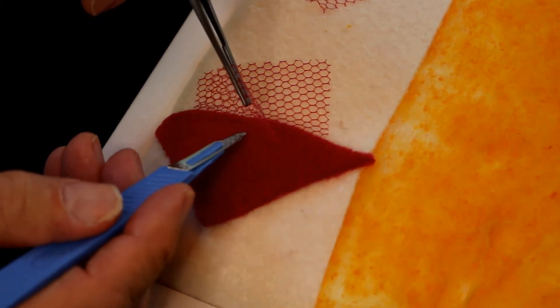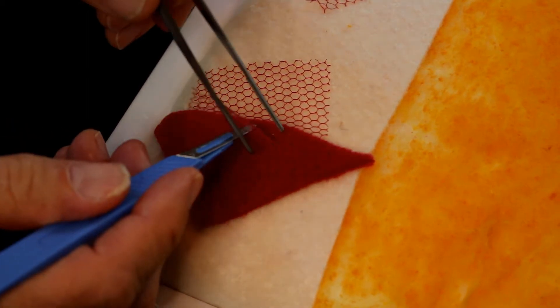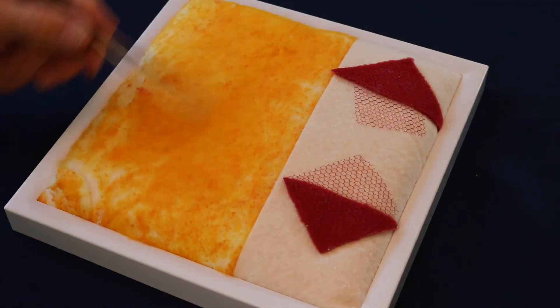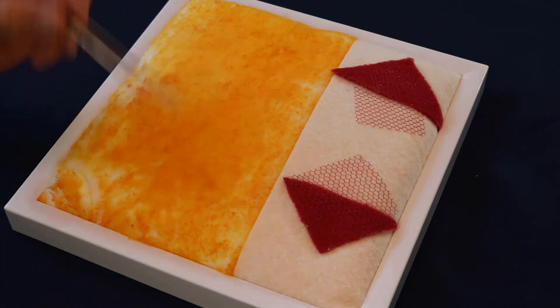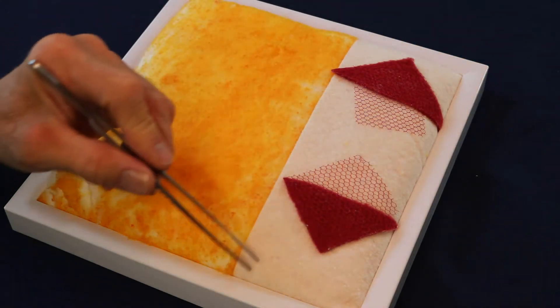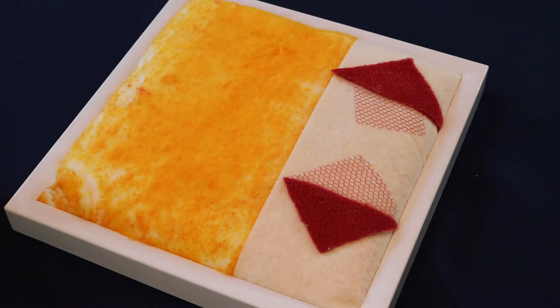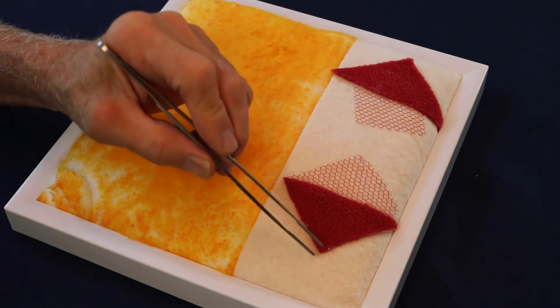In this exercise, we are going to separate tissues using retraction along with spreading and cutting techniques. On the board, you find a fluffy yellow surface that simulates subcutaneous fat. Adhered to this is a large piece of white material representing fascia or scar. In turn, adhered to this are several red strips and mesh that simulate tight tissue planes or scar.